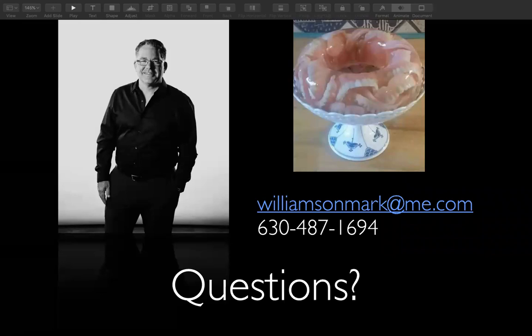Ideally, like I said, we really don't want to be cutting those down. When I start having to cut them down, I get worried. Sometimes in the anterior, you might be beveling them because you've got that lingual aspect and you can bevel that cylinder. You're cutting it down that way. But if it's in the posteriors, and if it's 1 or 2 millimeters, I'm okay. I have to be, right.